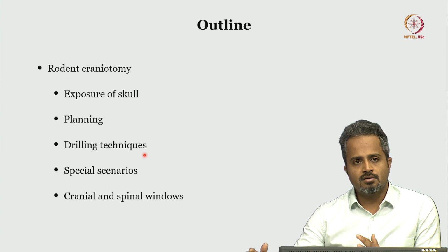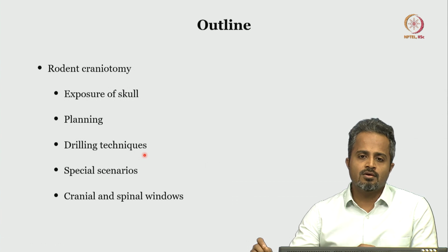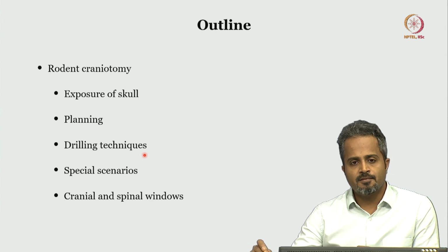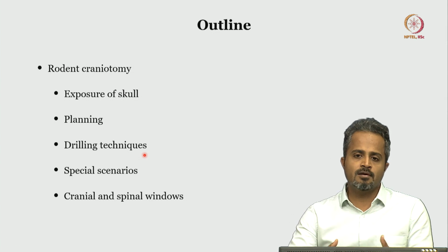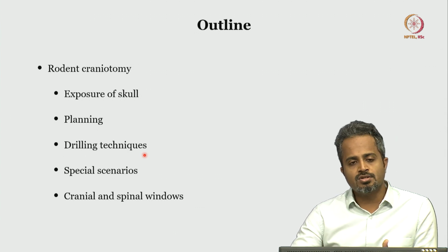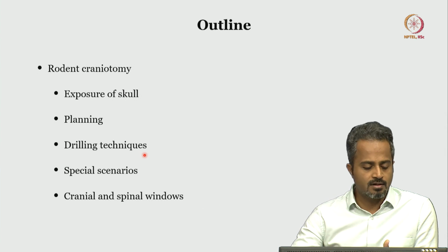Then I guess around 60 to 70% of the work is done if you are good in using the drill. So there is a significant learning curve in using the drill, and as I suggested earlier, try and use as much as possible the cadaver dissections to practice your drilling before you actually use your subjects or the experiment rats.